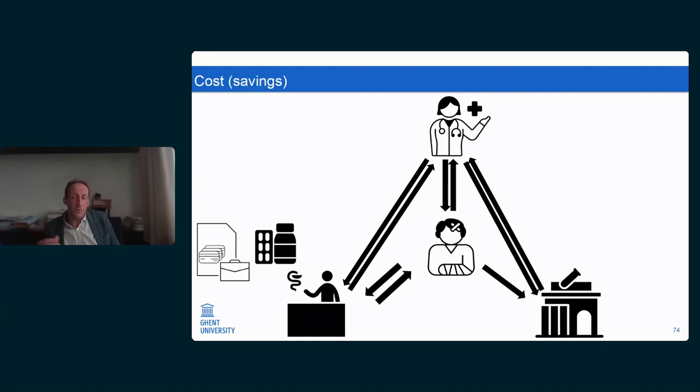Alternatively, the physician could also say to the patient, okay, I've really seen there's something wrong on your blood levels, because we know that longitudinally you're typically quite well under control, but I've seen now that your immunosuppressant levels are way different than they used to be. And I can also see that your creatinine levels, which were used also in the same sample, that they're off. So you should really come and see me. And so this actually may save time for this physician to really orient her or his attention to those patients that really need it, as you may have a better patient follow-up.